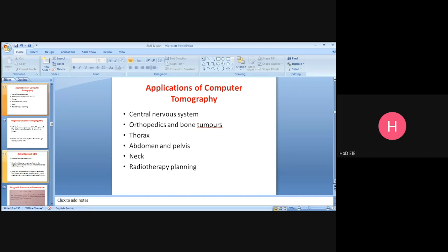So while you're taking this radiotherapy, along with that you can make use of the CT studies. Okay, that is, how much of the tissue volume is being irradiated, how much it can be reduced. So thereby you can avoid any unwanted radiation exposure to normal tissue. So nowadays, in CT scanning, you are incorporating 3D simulation facilities. Okay, that's what we can say about computed tomography.